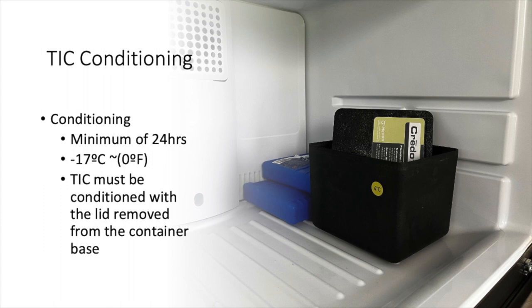To properly condition your TIC before using, all you're going to do is take the lid off of the TIC and place the lid and the TIC inside of the freezer for a minimum of 24 hours. The freezer must be at negative 17 degrees centigrade or colder, which is slightly below 0 degrees Fahrenheit. Any standard freezer is capable of this temperature range.